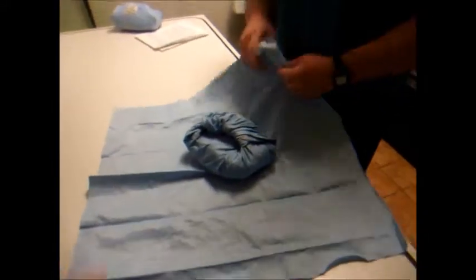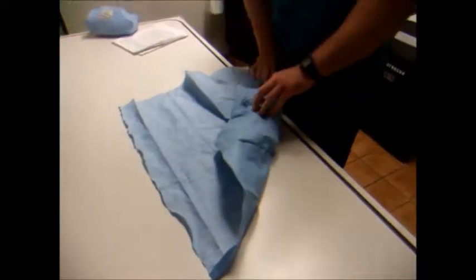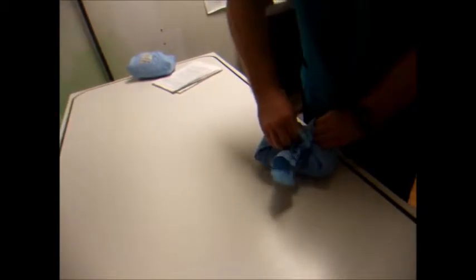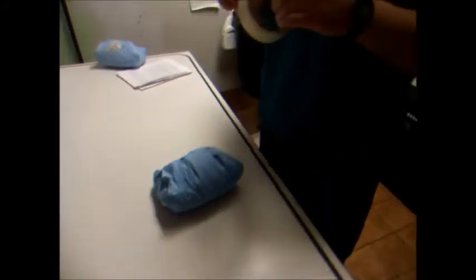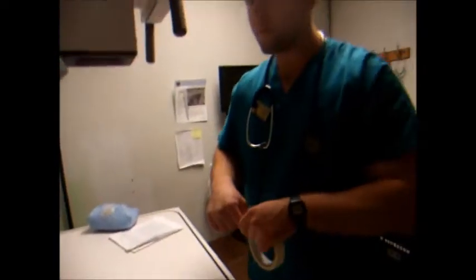Second level of draping. And then we're going to put indicator tape right on top. We're going to mark it with my initials and the name of the pack and the date it was done.